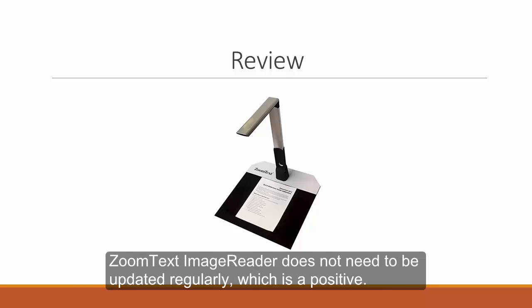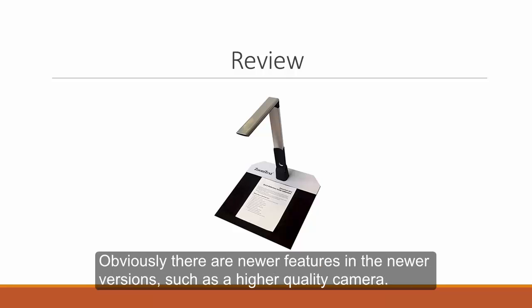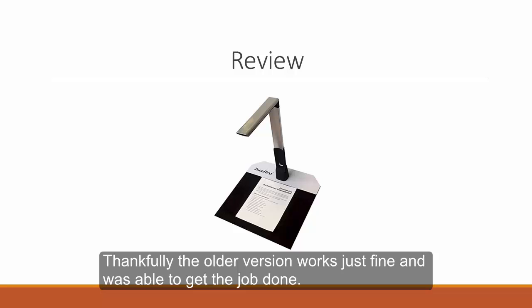Zoom Text Image Reader does not need to be updated regularly, which is a positive. For this demonstration, I used ImageReader 1.0. They have come out with 2 versions since, 1.1 and 1.2, and this one still works just fine. Obviously, there are newer features in the newer versions, such as a higher quality camera. Thankfully, the older version works just fine and was able to get the job done.